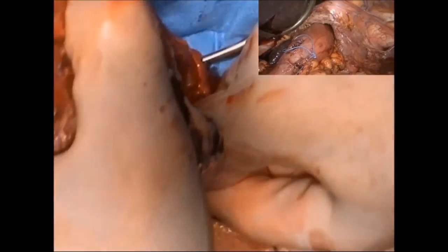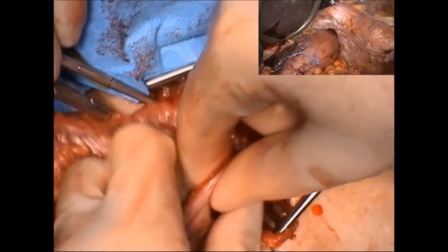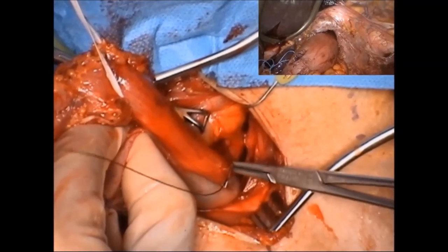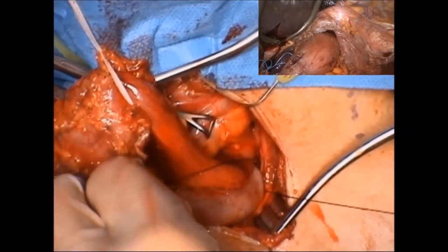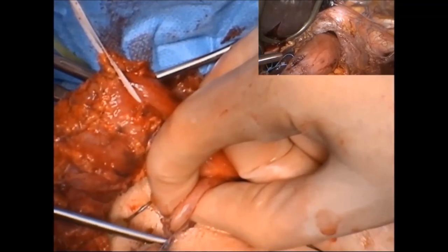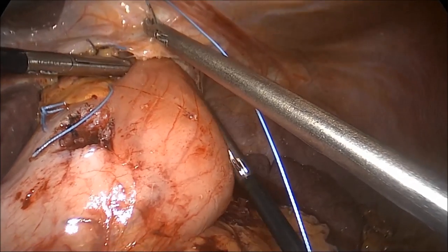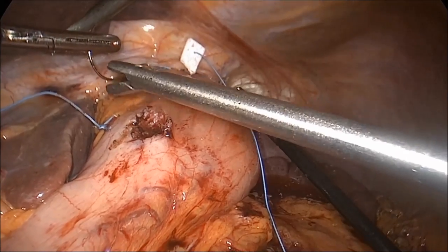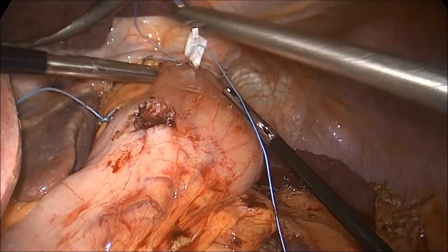The esophagus, gastroesophageal junction, and proximal gastric conduit are then brought up through the neck incision. A stay suture is placed between the cervical esophagus and the gastric conduit, then the sutures securing the tip of the gastric conduit to the specimen are divided. The esophagus is transected using scissors and the specimen is passed off the field. Because of a high rate of hiatal hernia following esophagectomy, the gastric conduit is secured to the hiatus using pledgeted 0-Tichron sutures along the circumference of the hiatus at intervals of 1–2 cm.